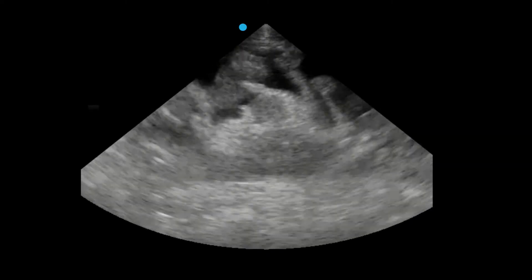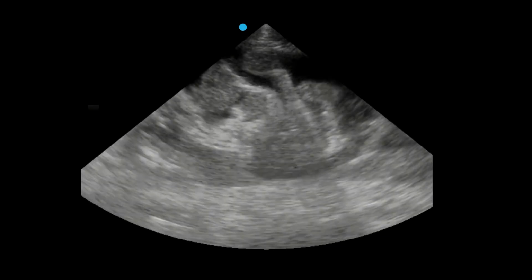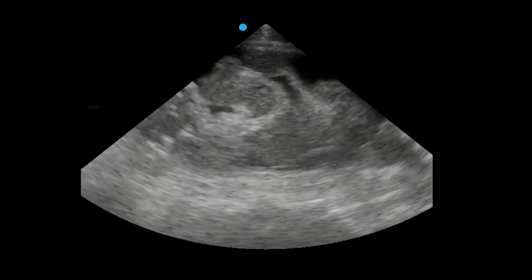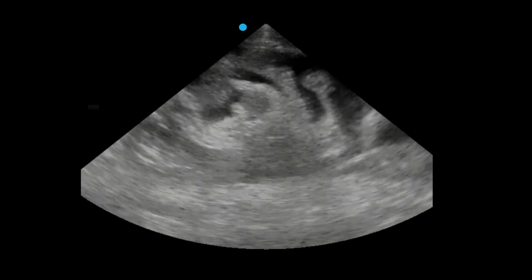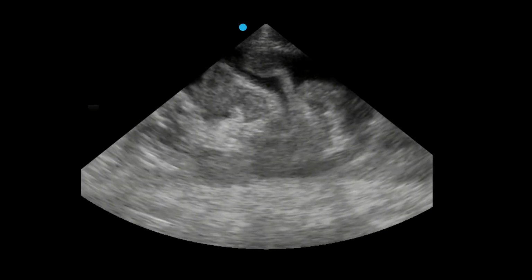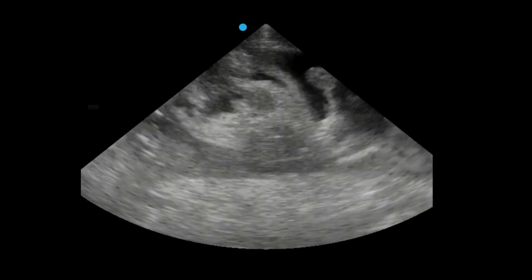The second major advantage is you're able to quantify your fluid. How much fluid or ascites is actually present? Often what I will do is start by using my low-frequency probe, either your phased array or your curvilinear probe, to evaluate for fluid. Perhaps you want to do a diagnostic paracentesis procedure to check for an infection. Before doing so, I'll actually check the various locations to see if there is, in fact, enough fluid present for me to safely perform my procedure.